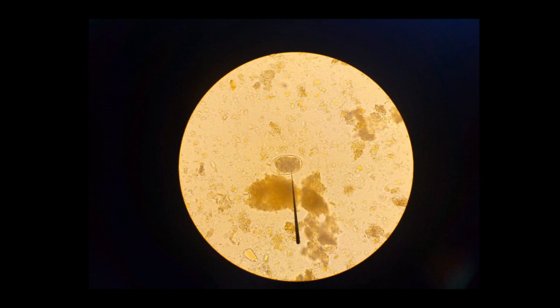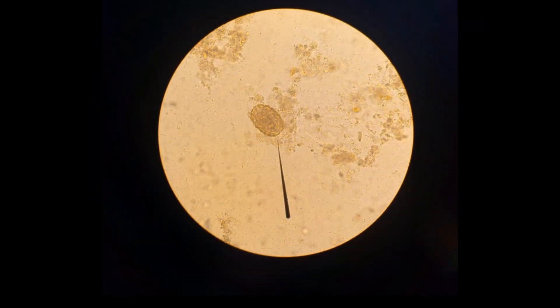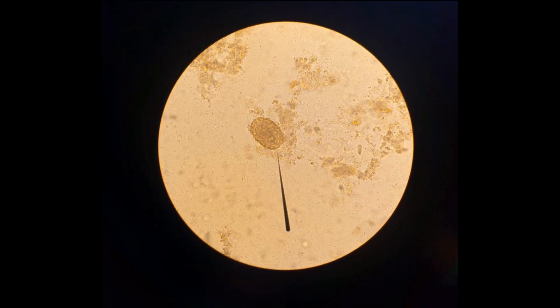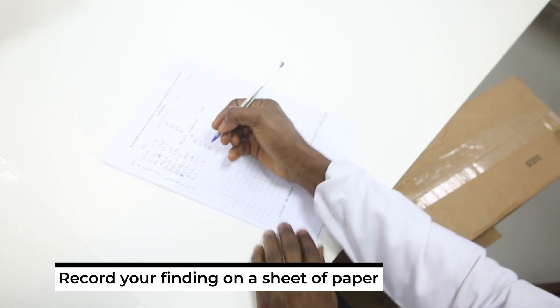Look for cysts of protozoans, and eggs and larvae of helminths. You record your findings on a sheet of paper, then enter your results on the computer.